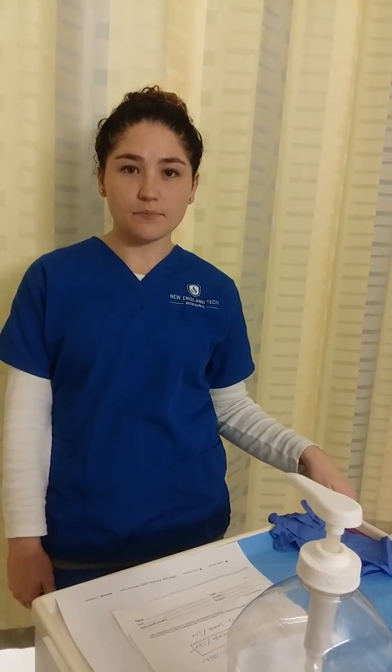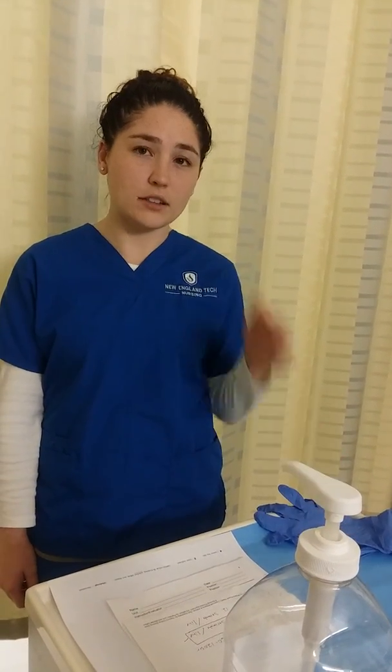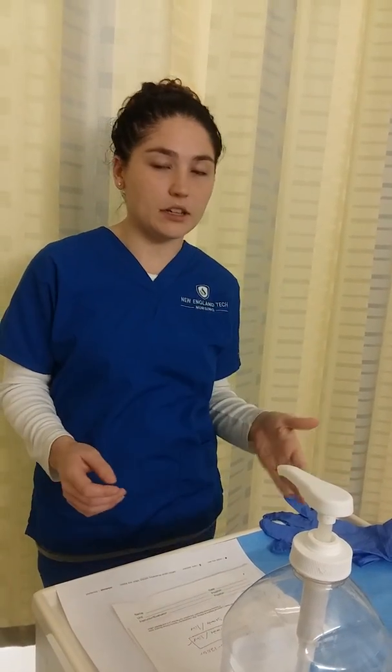Hi, I'm Savannah and I'm going to be administering medication through an IV today. The first thing I'm going to do is gather my equipment, which is some gloves and alcohol pads. The next thing I'm going to do is check my medication order to the medical record of my patient.